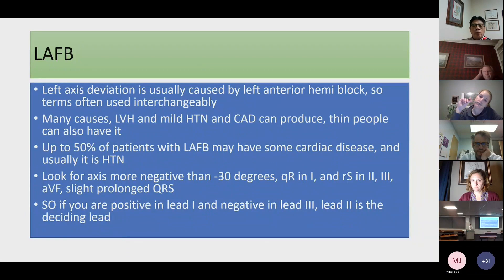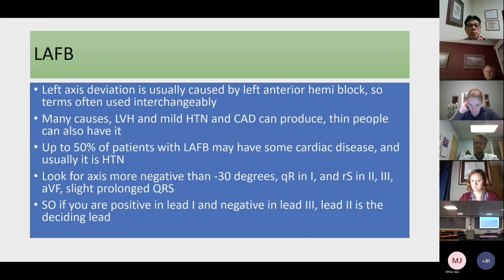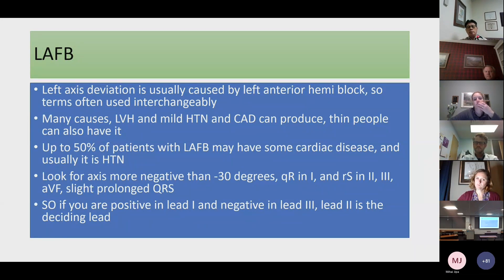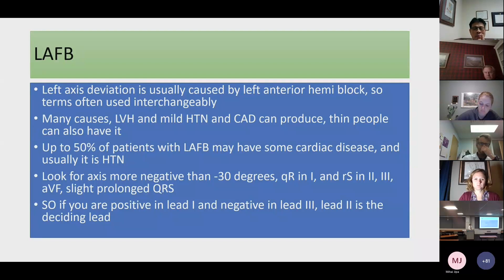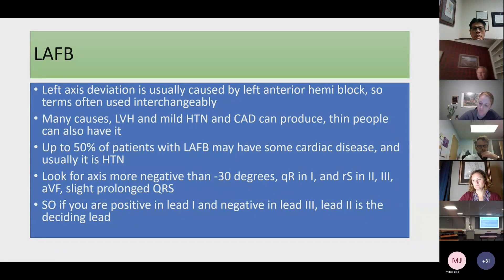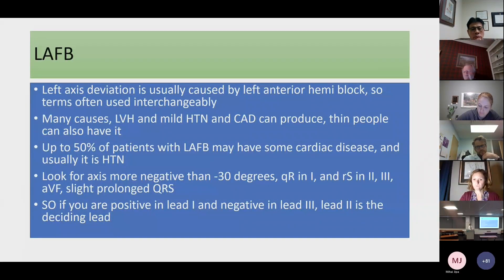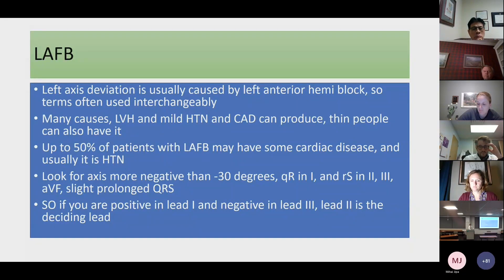Left axis deviation is usually caused by left anterior hemiblock — the terms are often used interchangeably. There are many causes: left ventricular hypertrophy, even mild hypertension, coronary artery disease with damage to the electrical system, and thin people by body habitus. Up to 50% of patients with LAFB may have some cardiac disease, usually hypertension. Key criteria: axis more negative than negative 30 degrees, an RS pattern in leads 2, 3, and AVF, maybe a slightly prolonged QRS. If you're positive in lead 1 and negative in lead 3, lead 2 is the tiebreaker.